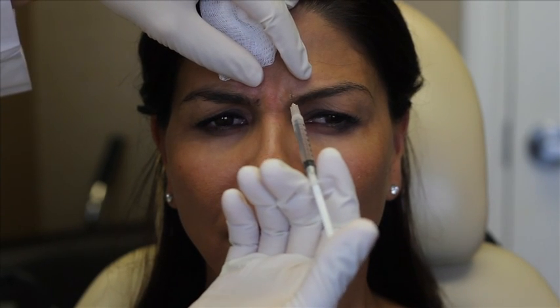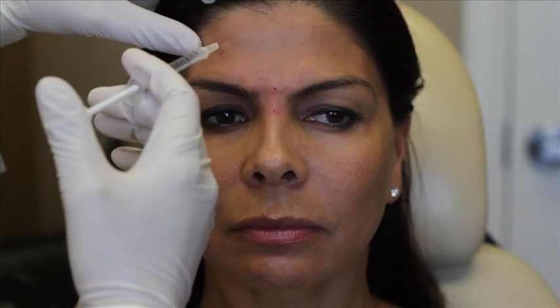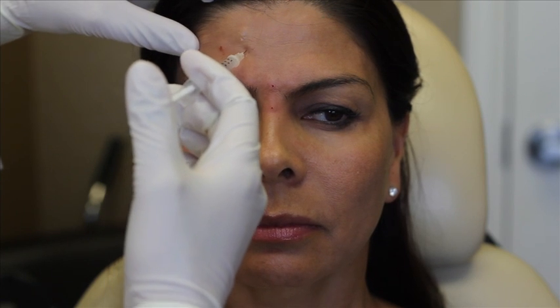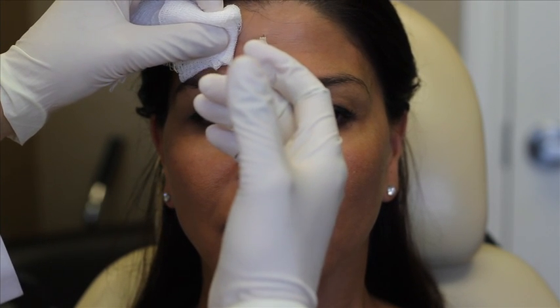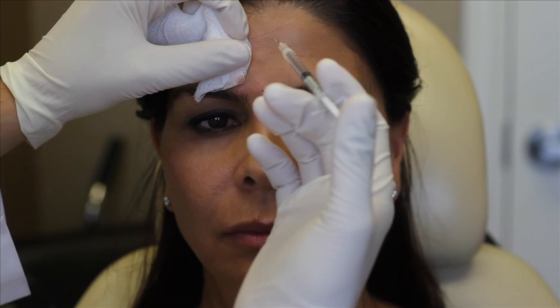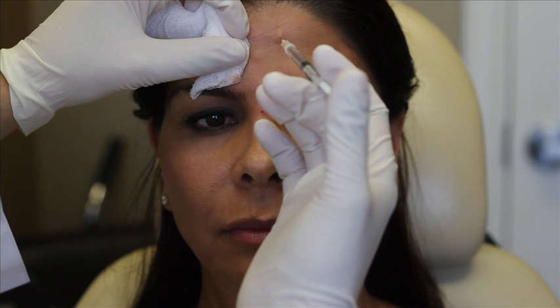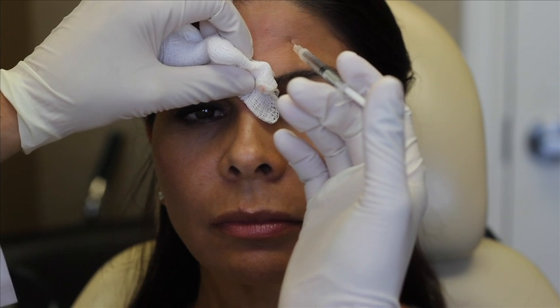And go ahead and frown and relax. Good. Raise your forehead for me and relax. So I'm going over the frontalis. Now I don't want to paralyze everything. I think that's really key, is not to paralyze the entire thing. You still want to have some dynamic action, but selectively, usually my injections are above the line of action of that muscle.